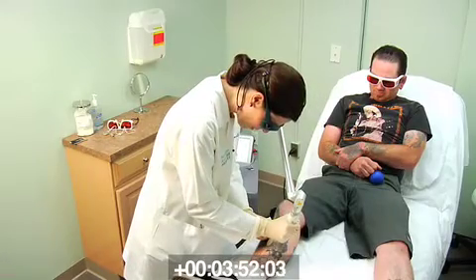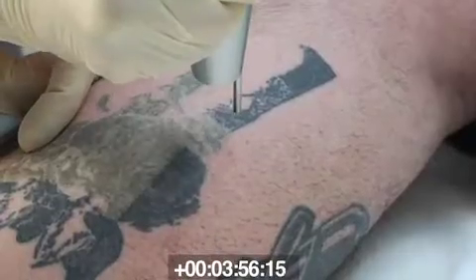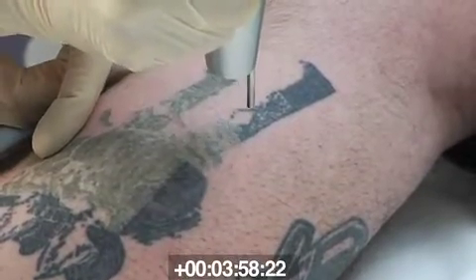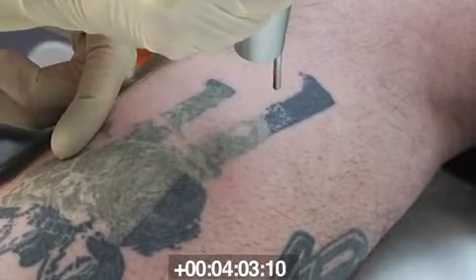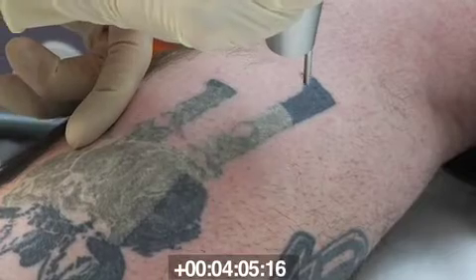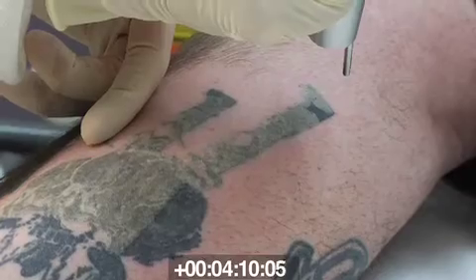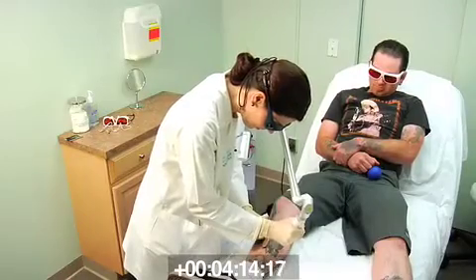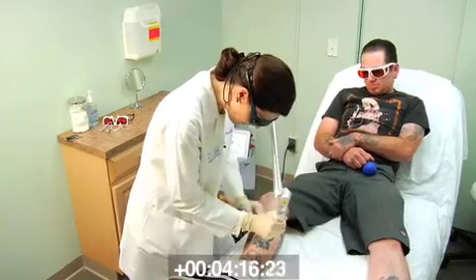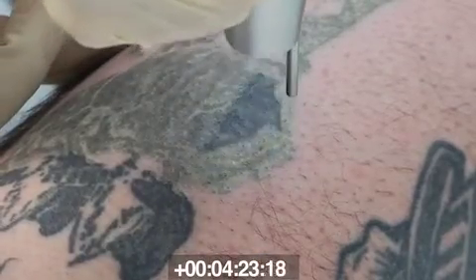3, 2, 1. I'm going to be over in here. I'm going to have you rotate your leg for me and stay right there. 3, 2, 1. So immediately after tattoo removal treatment, you want to apply ice.